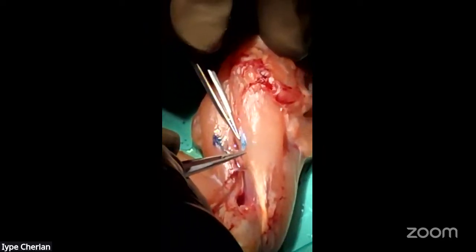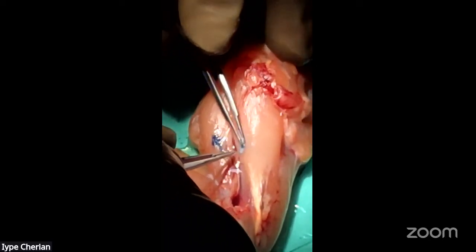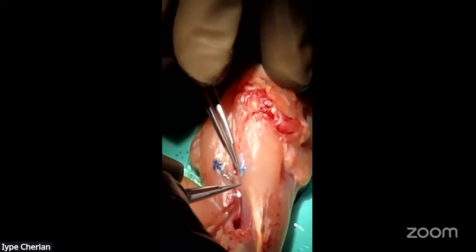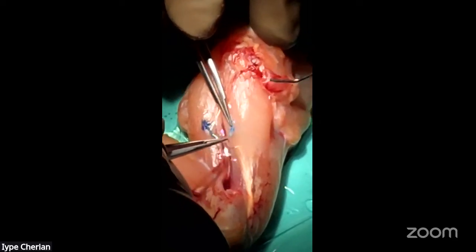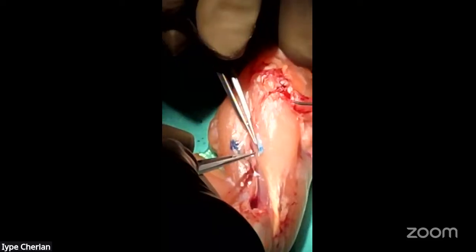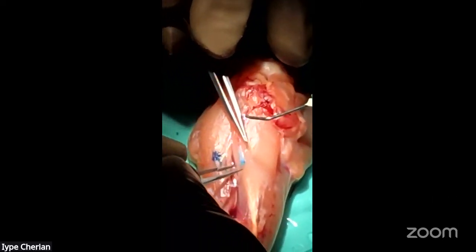And you can see the sutures coming in. I can use any of my hands. It's the beauty of ambidexterity. So that's the left hand suture. And now I'm showing a right hand suture.